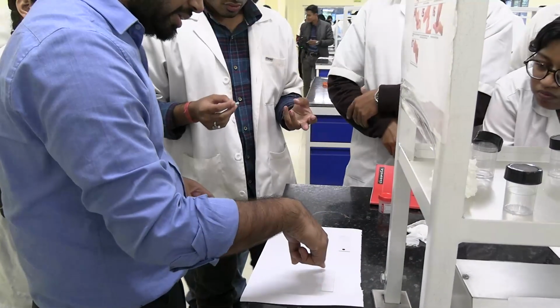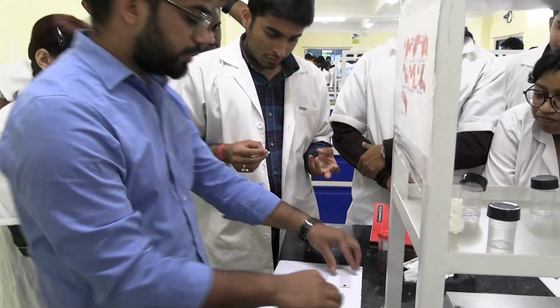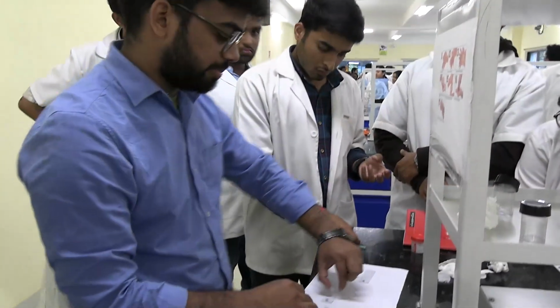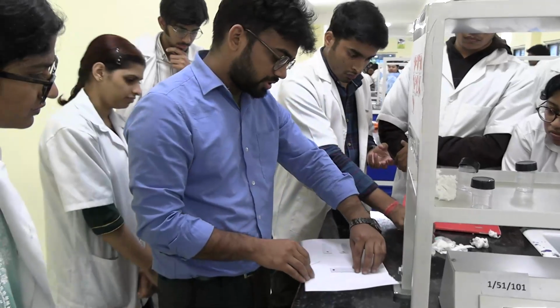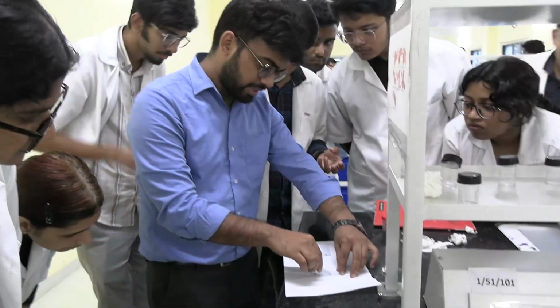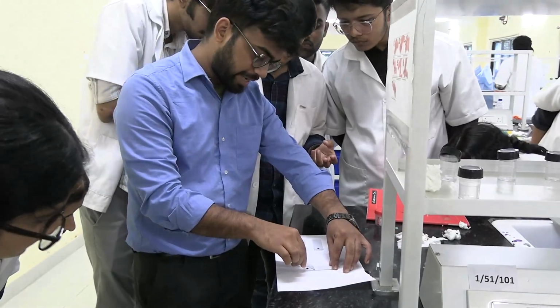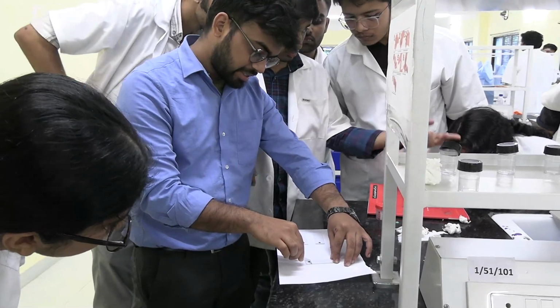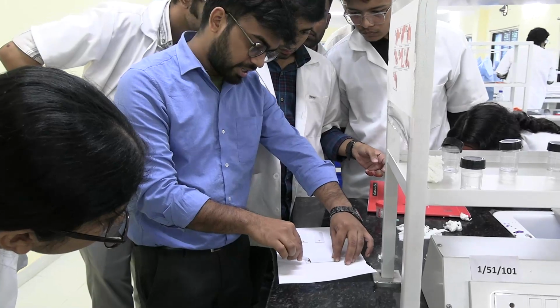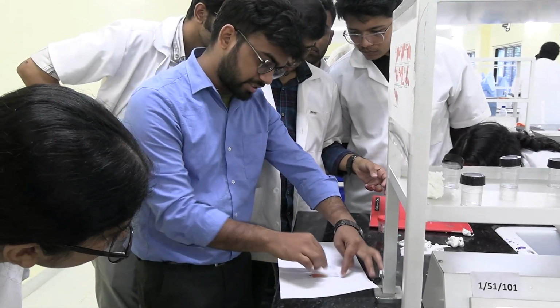Now this one is the smooth one. Now you can use it like so. Okay, I am taking it. You can also take it like this. Suppose one is more comfortable like this, so how will we do it? You will place it from here, bring it back, and then touch it. Just spread it. Now at an angle of 45 degrees, I am going to do it like this.